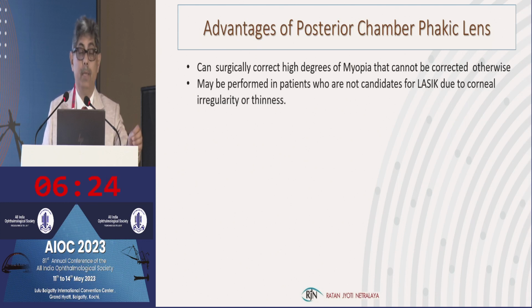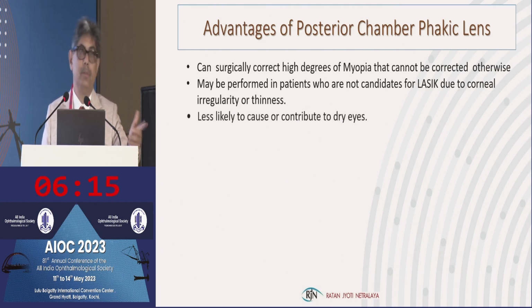It may be performed in patients who are not candidates for LASIK due to corneal irregularity or thinness. So in low myopes also we can use this. And it is less likely to cause or contribute to dry eye.